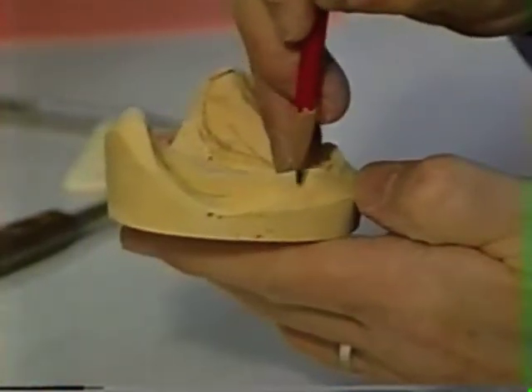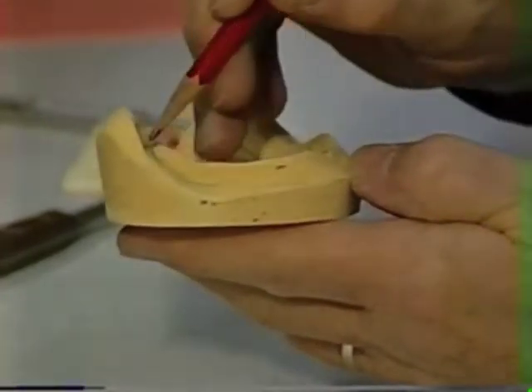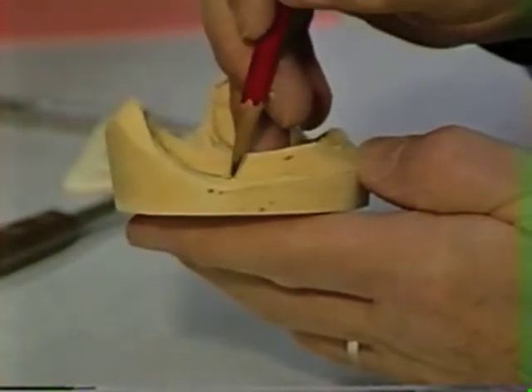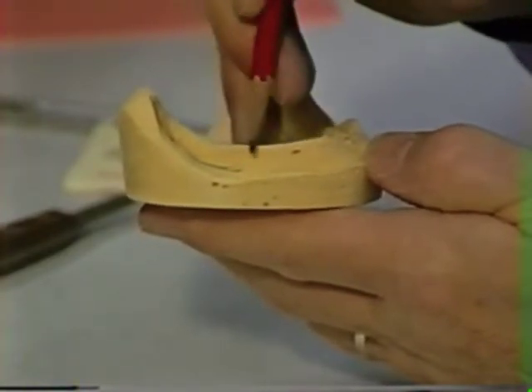I can see a faint indication here of the buccal frenum right here, and it comes to about that height right there. So our external oblique line is coming down here now. We're going to allow our tray to come along on the external oblique line until that external oblique line sort of disappears on us and you can't find it anymore.